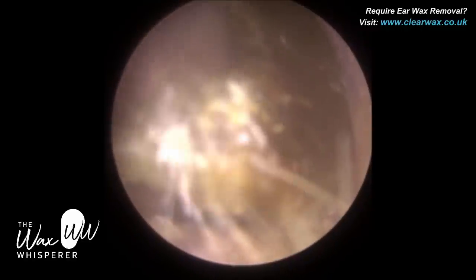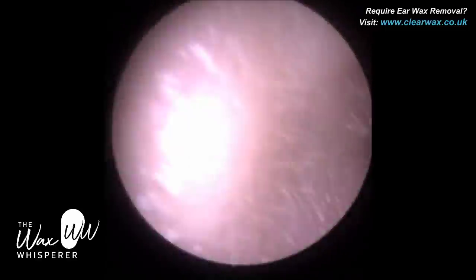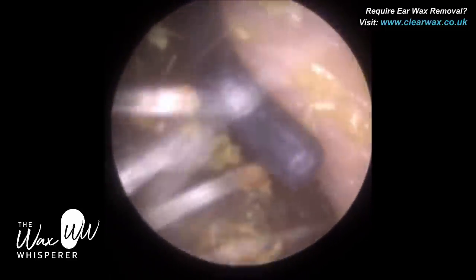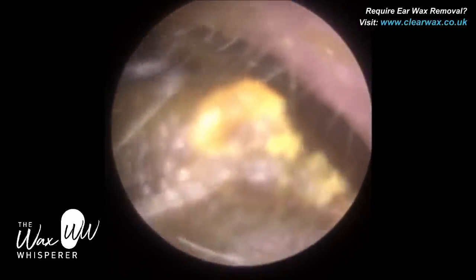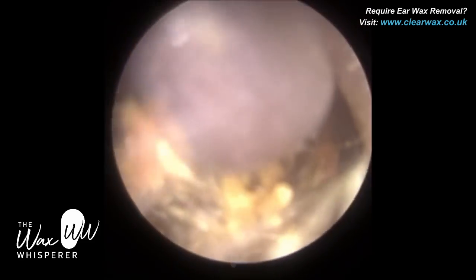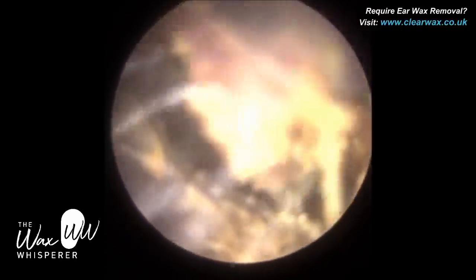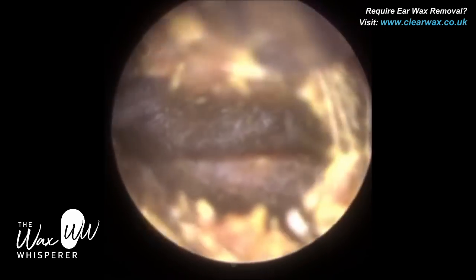In the past, he's used all forms of ear wax drops, such as olive oil, hydrogen peroxide, and sodium bicarbonate, and he's sensitive to all of those. So we've had to remove this bilateral occlusion without the assistance of any drops. You'll see the drops would have been very useful on several occasions during the procedure. So we just have to plough our way through — it's a bit of an epic journey, hence the name: an epic ear wax removal.